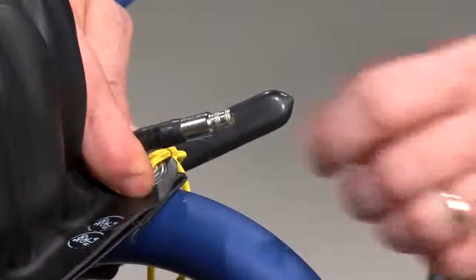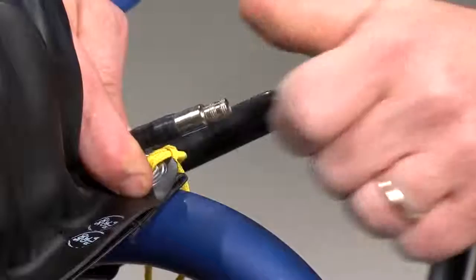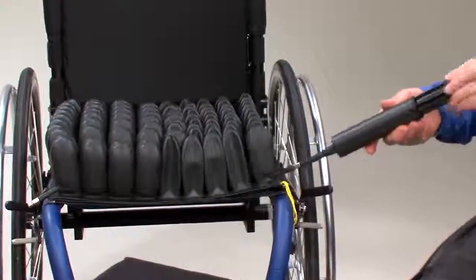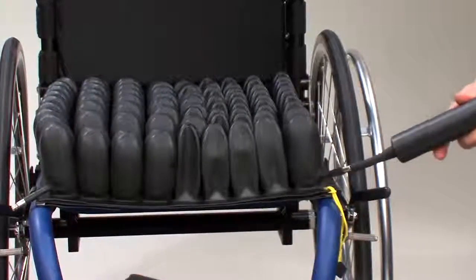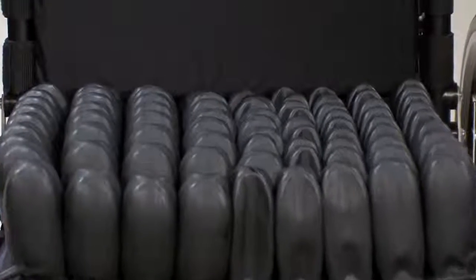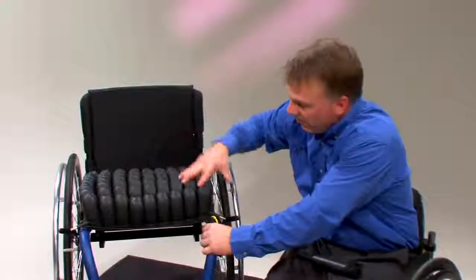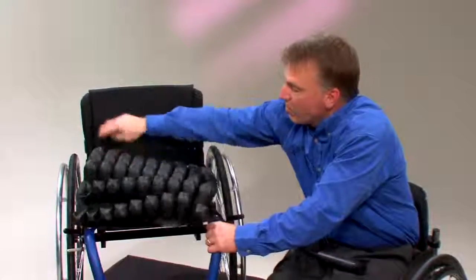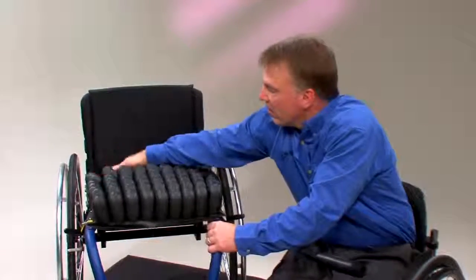To adjust the dual compartment cushions, follow the previous stated instructions pertaining to multi-valve cushions. To maximize the positioning benefits for individuals with pelvic obliquity, the side with the deepest and lowest bony prominence must be adjusted first. Dual compartments may be used for side-to-side or front-to-back positioning. For those who use front-to-back positioning, adjust the rear section first. Once both adjustments are made, recheck each compartment to ensure proper adjustment.